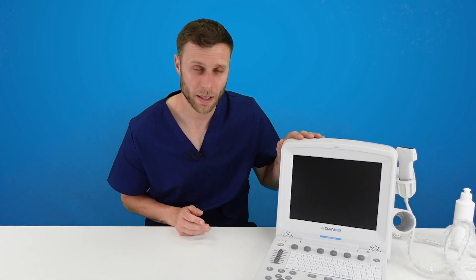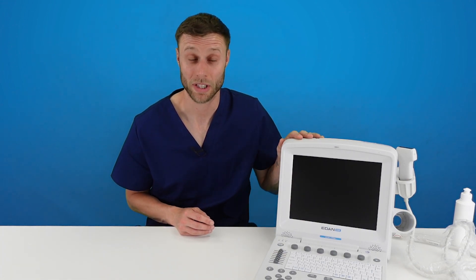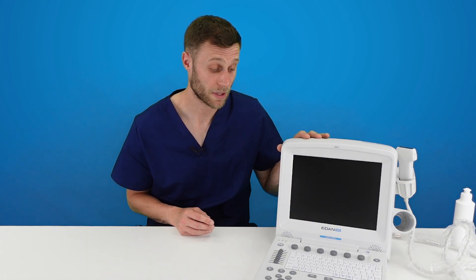Hello, welcome to this video. In this video we are going to look at the EDAN U50 Prime Edition. Now this isn't a system we stock ourselves and as a result not a system we would necessarily recommend. But we have just received one into our office so we thought we'd take the opportunity to do a quick run through of the controls of the system and how to use it. If you have any questions please just let us know and drop them in the comments below.